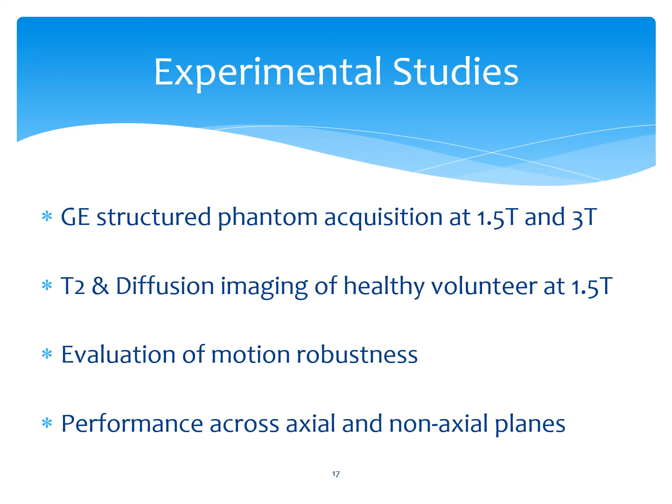To assess the sensitivity to motion and the performance of steer prop in motion situations, a third experiment was set up to compare motion sensitivity against the standard FSE sequence, the FSE propeller sequence, as well as the steer prop sequence. Finally, in a typical single-shot EPI sequence, there are substantial distortions due to orientation-dependent susceptibility effects, primarily in non-axial planes. So we conducted an experiment to compare the performance of steer prop against single-shot EPI on both axial and non-axial planes.